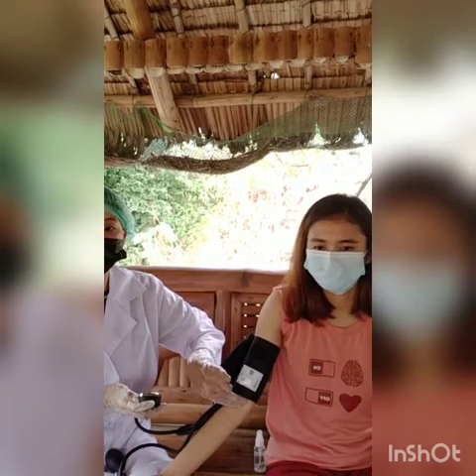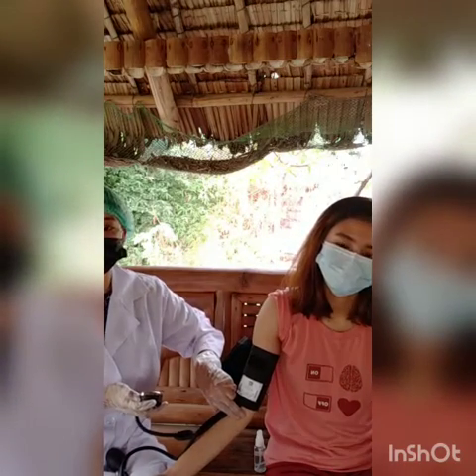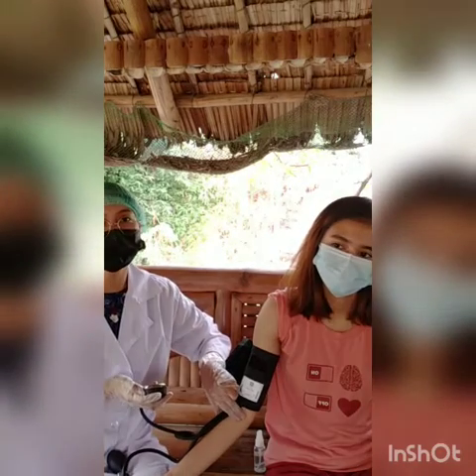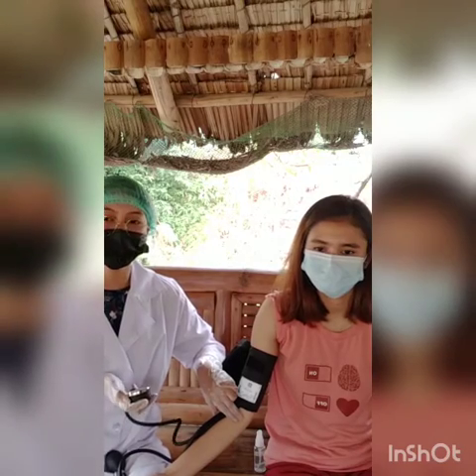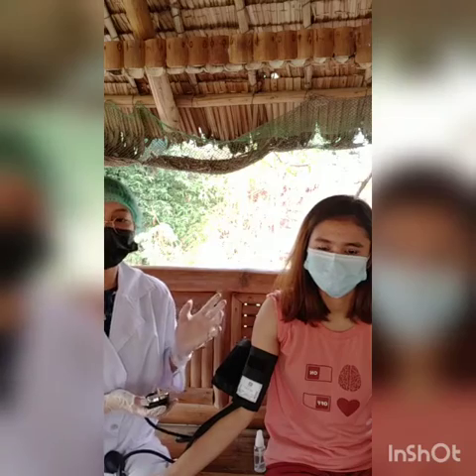And then, after that, tighten the screw valve on the air pump. And then, inflate the cuff while continuing to palpate the artery and note the point of gauge where the pulse disappears. And then, deflate the cuff and wait 1 minute. And then, after that is obtaining blood pressure measurement. So, assume a position that is no more than 3 feet away from the gauge.